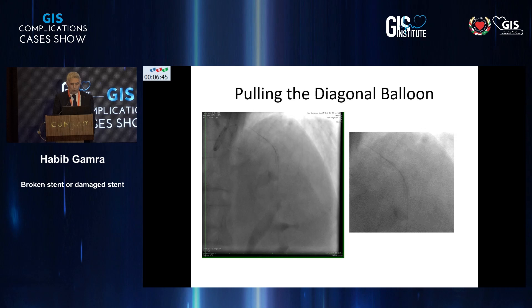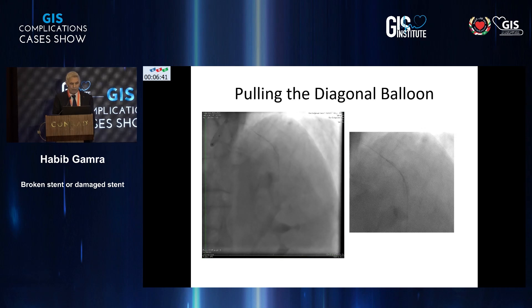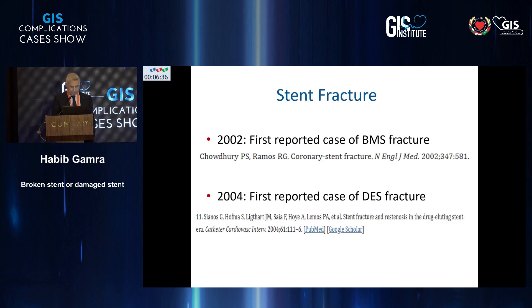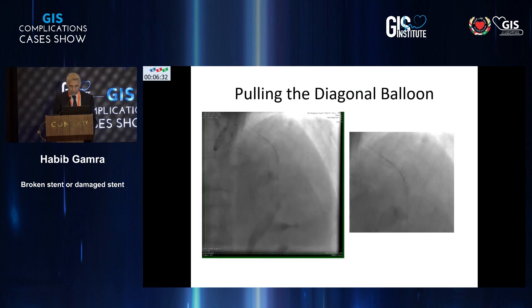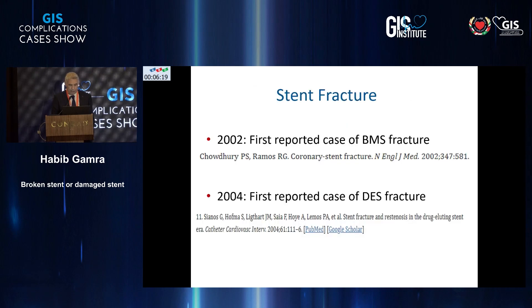This is what he had seen after pulling out the diagonal balloon. This is a stent that was fractured, as you can see here on the stent boost — one segment and the other one. This is actually a stent fracture.